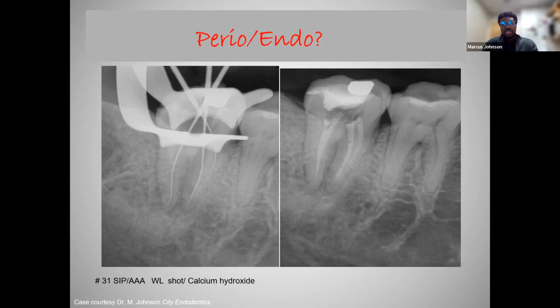He was in a lot of pain, and he obviously had this gingival abscess. So I was able to get my working length and place calcium hydroxide. I still love calcium hydroxide. That's up for debate. I believe it was introduced into the literature around 1920. A gentleman named Herman brought that to our knowledge. We love it because of the hygroscopic nature; it's going to dry out canals. Obviously, with the high alkalinity, it's going to be an antimicrobial. Lots of different factors, and so I wanted to use it to give this tooth the best chance of success.